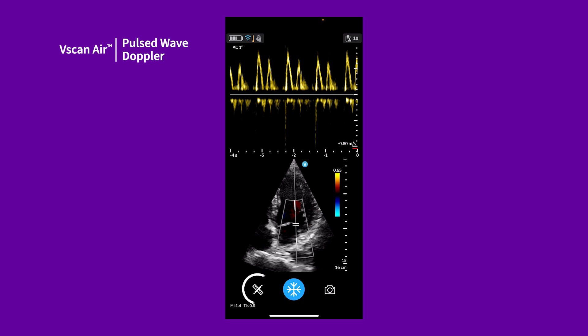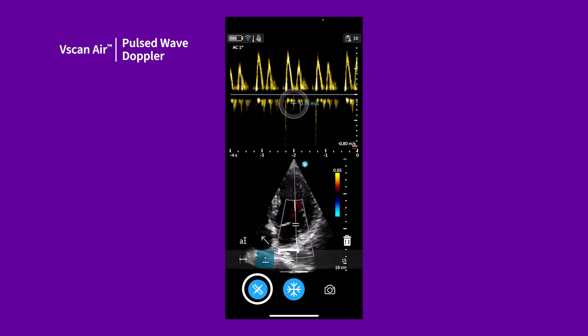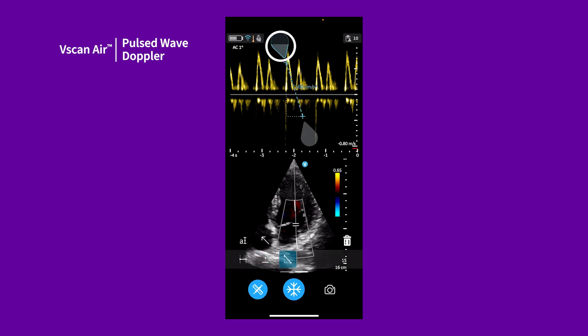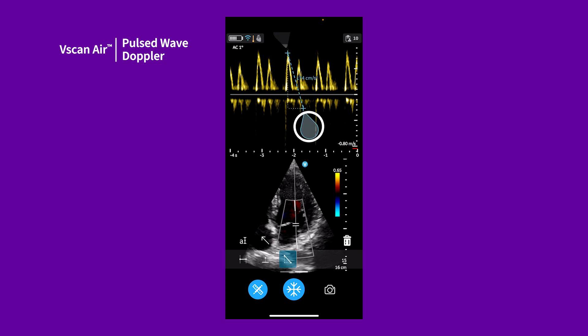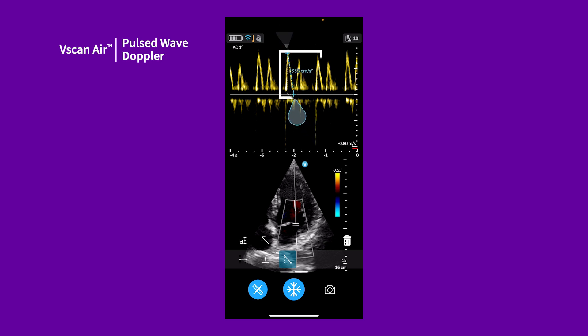Let's do a slope measurement. Tap the slope measurement option. Drag to position the calipers on the trace and the system will display the slope measurement result. Press the store icon to save.